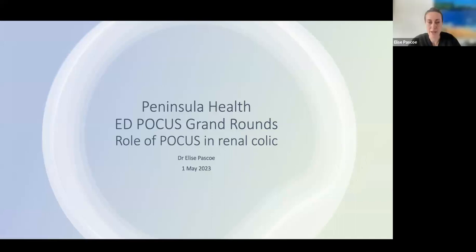So as background, I've been doing quite a lot of ultrasound in the ED lately, and ultrasound of the kidneys is something I've only done a couple of times and found it to be quite useful and interesting. So I wanted to learn a little bit more about it. And as part of this presentation, I seem to have accidentally gone on a little bit of a deep dive on renal colic and our imaging choices.